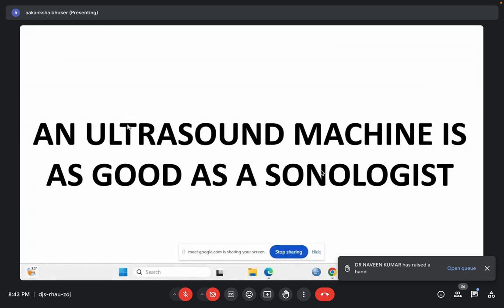Good evening, ma'am. I have one question. Yes, Raksha. Ma'am, to correct reverberation, we have to change angle. Then how can we change the angle?